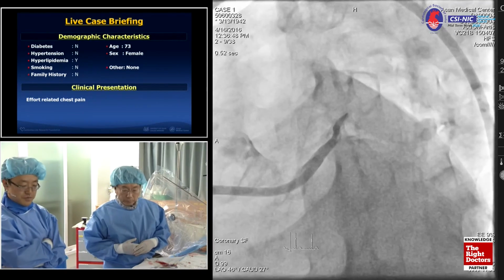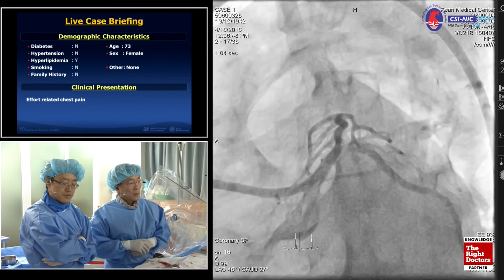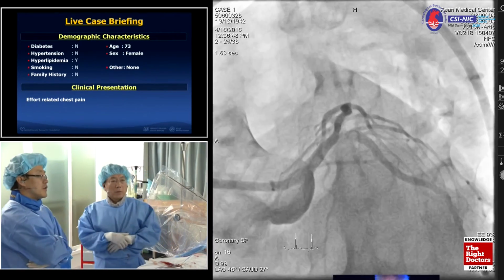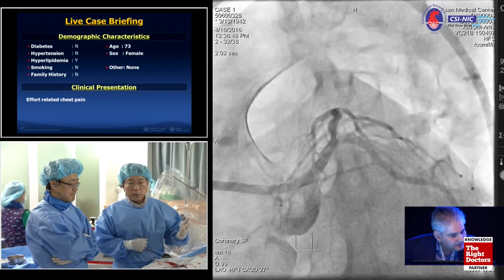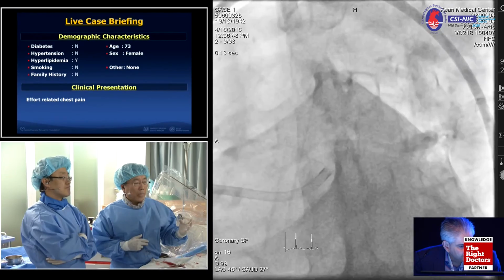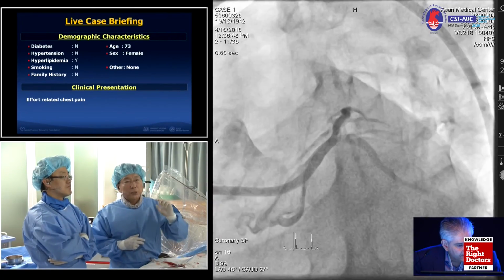Having a stent with stenosis already, plus the fact that this is a distal bifurcation left main disease, has there been any thought about surgery? Has there been an MDT discussion with the surgeons? Have you discussed the possibility of a bypass operation? We clearly considered the possibility of bypass surgery. However, the circumflex ostial restenosis would be the first time, and this is a very angiographically discrete lesion.